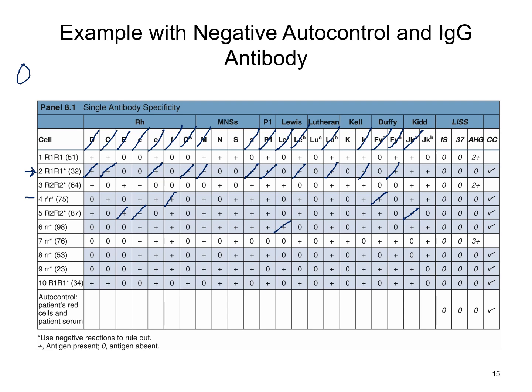Alright, next cell, I'm just going to go down and look at N and see if I can rule it out anywhere because I've narrowed it down. So it looks like I can rule out N on this last one, not here on number 9 because it is a hetero. And big S I can rule out here.